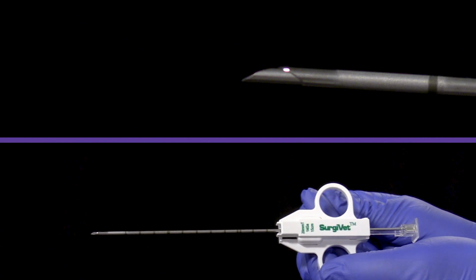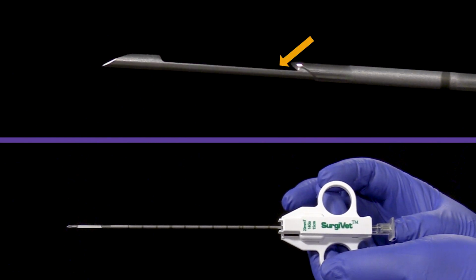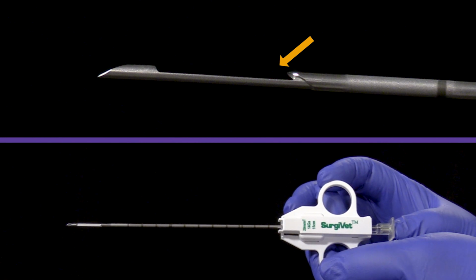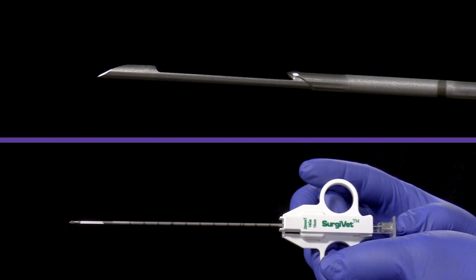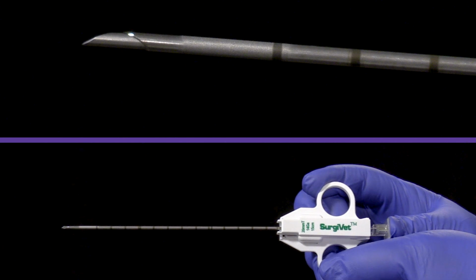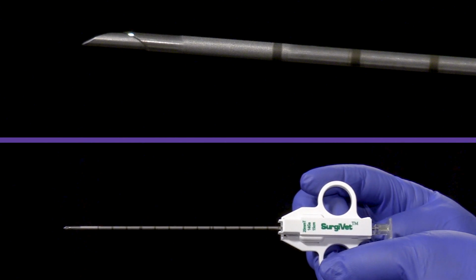Next, observe how gently pushing the inner stylet forward until resistance is felt opens the biopsy trough. This is done after you penetrate the liver. Next, observe how putting pressure on the handle causes the outer needle to snap shut, capturing the biopsy in the trough. After this step, the biopsy needle is ready to remove from the animal without further action.